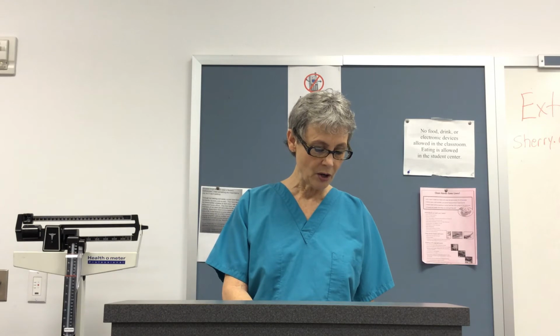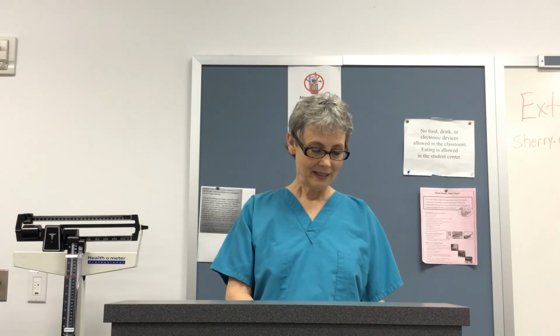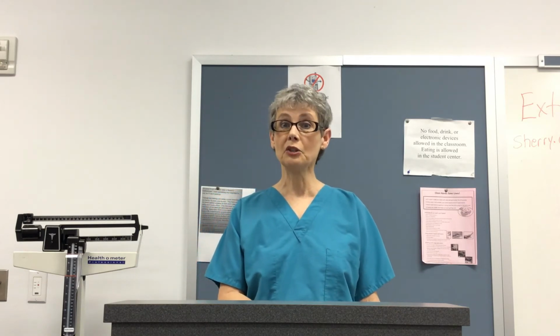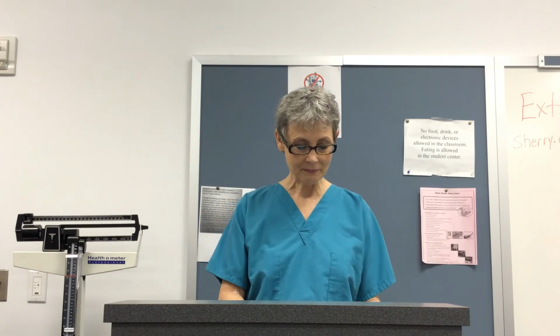R, there's several R's here. R is for right rate, R for release clamps. Remember, it won't infuse if your clamp is clamped. And then the last R is for return and reassess patient. So after you start an IV, after you hang IV fluids, after you hang IV piggybacks, you will be returning to check on that patient.